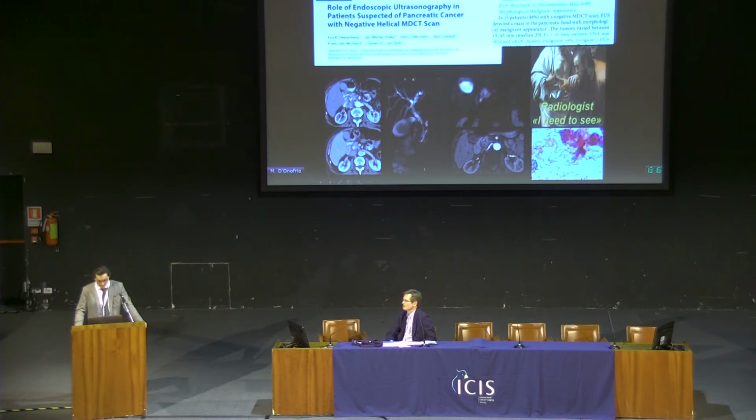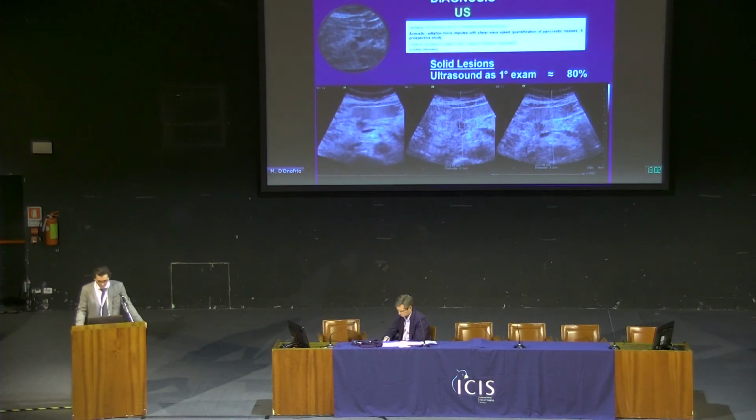And this is unfortunately due to the fact that it was stented, there is an endoprosthesis inside, so never perform CT and MR after the catheter, the endoprosthesis, the stent in the biliary tree.